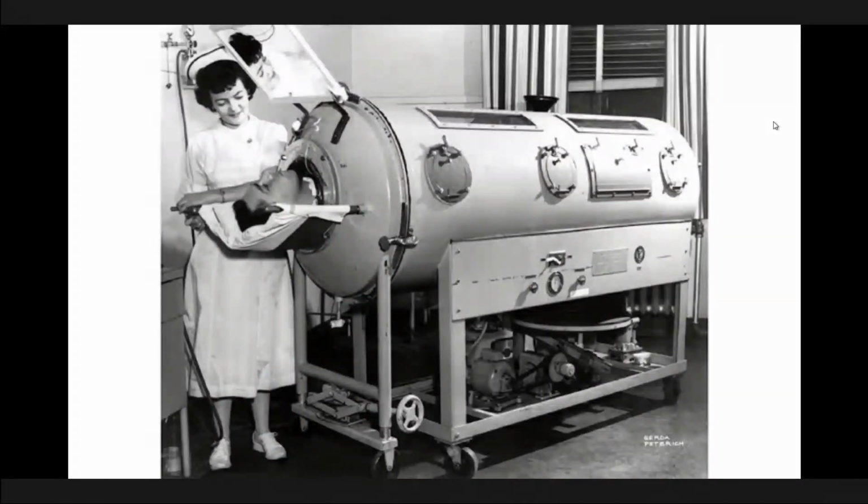Now you can have a look at this device. This is an iron lung, which was widely used during the polio outbreak, and this ventilator uses negative pressure ventilation. You can see that the patient's body is completely encased by the iron lung. It just leaves the head free, and the limbs are completely covered. It had many disadvantages because the patient was not mobile. But the method used here was that a negative pressure gradient is developed wherein atmospheric air can enter the patient's lungs. This kind of mechanical ventilation is not used currently.